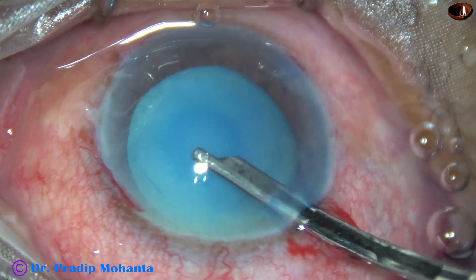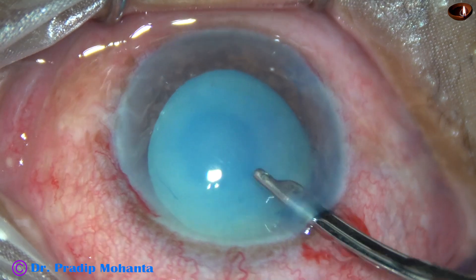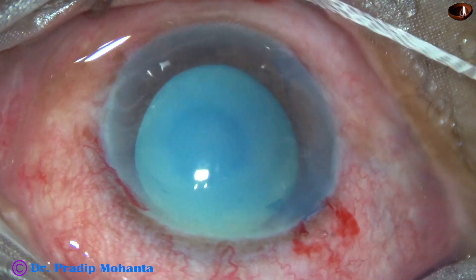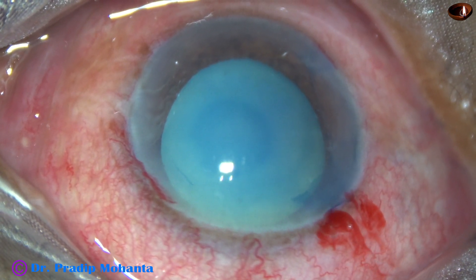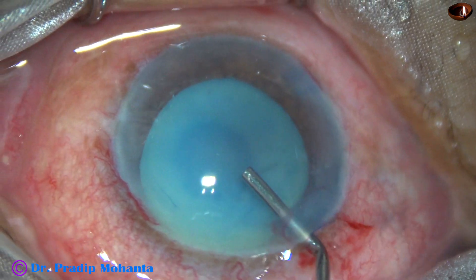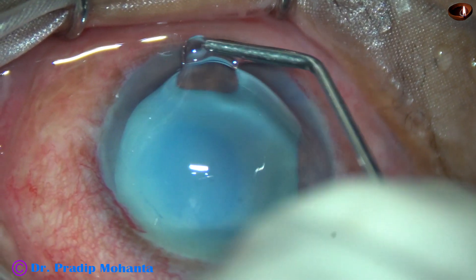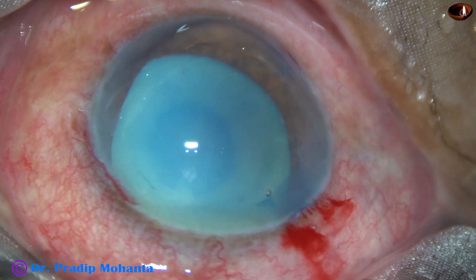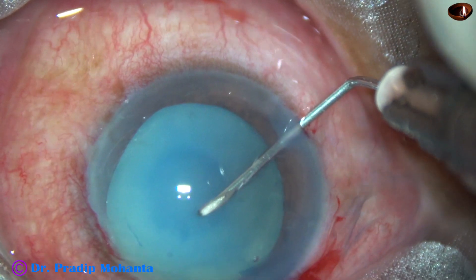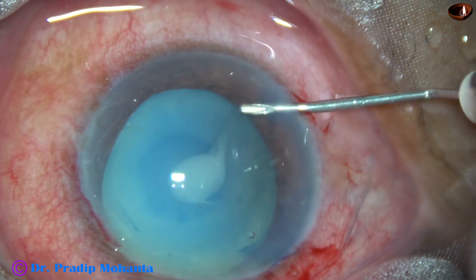In hypermature Morgagnian cataracts, we need not do a small rhexis first. We can just make a puncture, go for a distance, and then aspirate the milky fluid. In this case, let us see what happened as I made a puncture on the anterior capsule. To improve visibility, I have applied some viscoelastic over the corneal epithelium. As soon as the anterior capsule is punctured, milky fluid comes out.